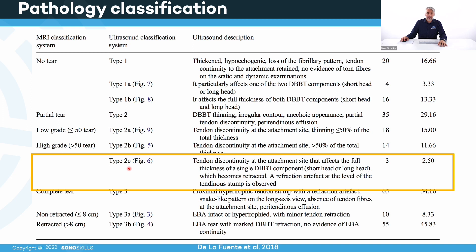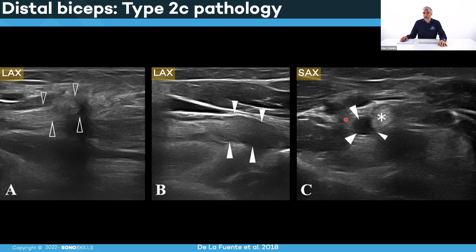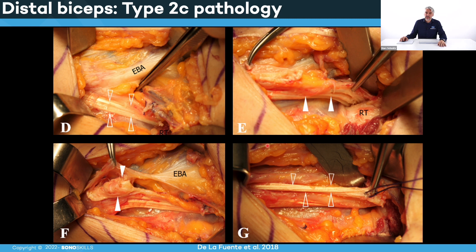In Type 2C, the full thickness of a single biceps tendon is torn but the other part is still intact. In the cross-sectional image, one part is still healthy — hyperechoic, oval-shaped — but the other part, in this case the short part, is completely torn: anechoic fluid, no fibers intact. It is a partially affected tendon but one whole part of the tendon is gone — a Type 2C pathology. You can also see this intraoperatively, where parts of the tendon are affected and other parts are intact.